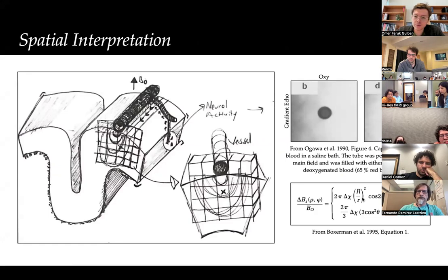I made it up just to change something in the extravascular space, to give a different spatial feeling. It is just there to demonstrate how you can measure phase Laplacian change. What could be happening if you are measuring large fluctuations in the phase Laplacian? I believe it can be due to vein diameter changes, vein angle changes.